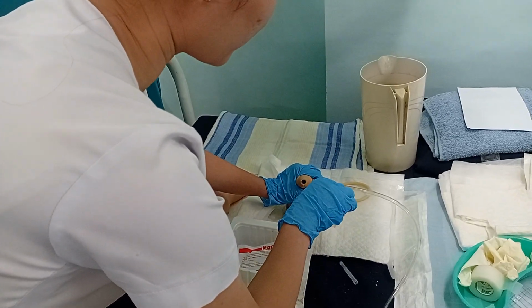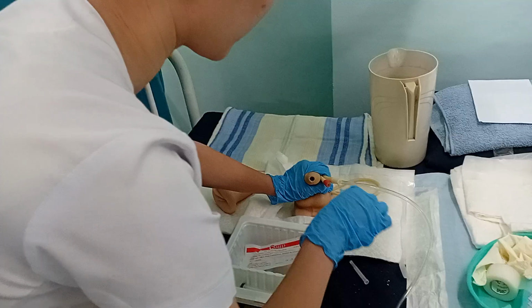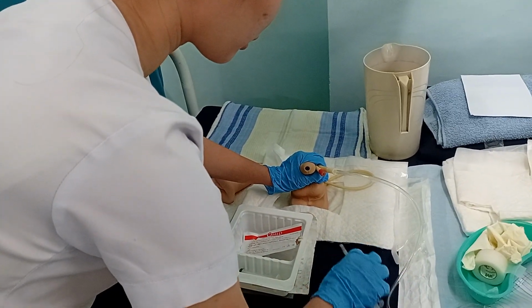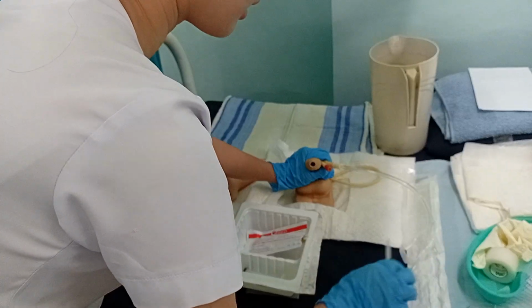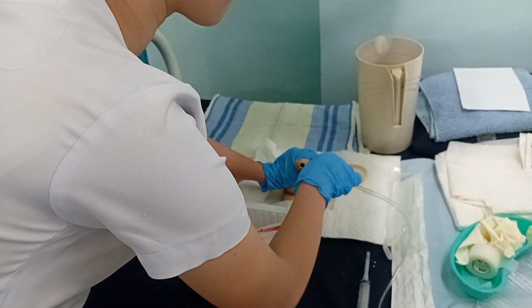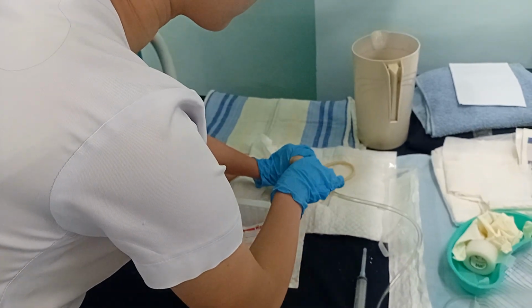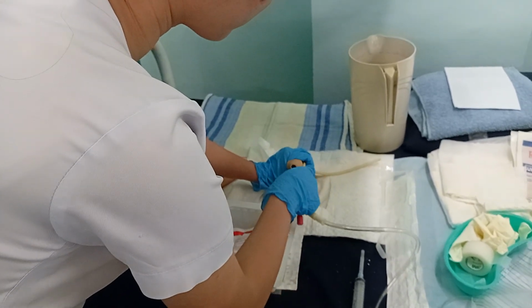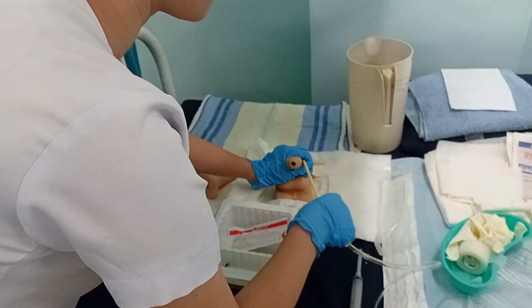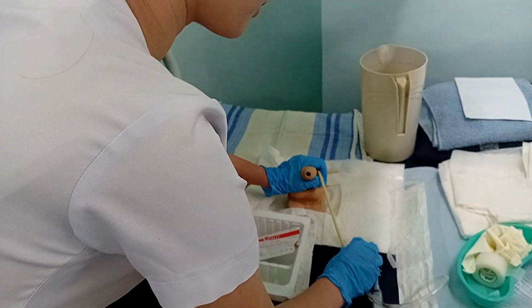Assuming you already inflated the balloon, what will you do with your syringe? We're going to remove the syringe, using the tissue. Okay, remove. And then after, we are going to tug slowly until we meet resistance. And when you meet the resistance, what will you do? We are going to secure the catheter with the tape.